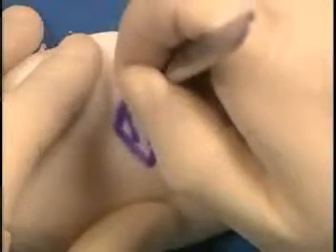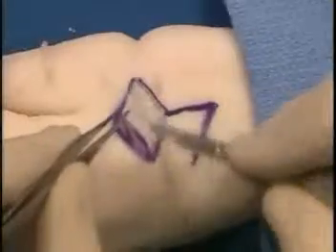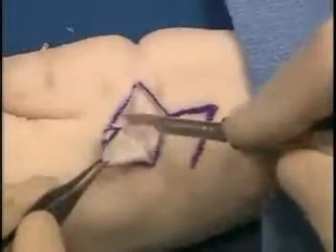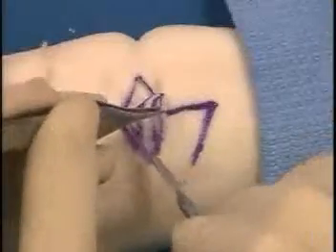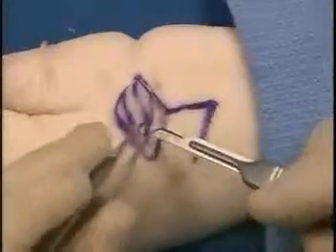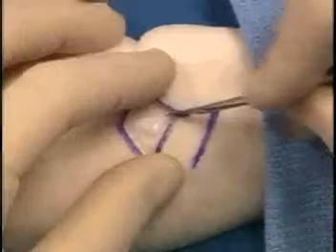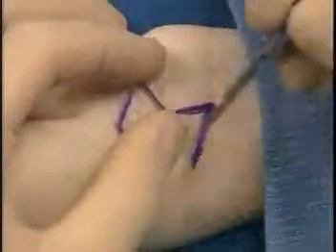The lesion is now excised by utilizing a 15 blade, picking up the edge of the lesion and dissecting it free with a number 15 blade down to the subcutaneous tissues. Notice also the other limbs of the flap are the same length as the parallelogram of the rhomboid flap. The angles are approximately 120 degrees and 60 degrees, and that's how the other limb of the flap is fashioned.